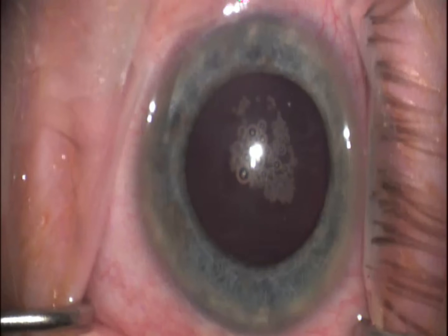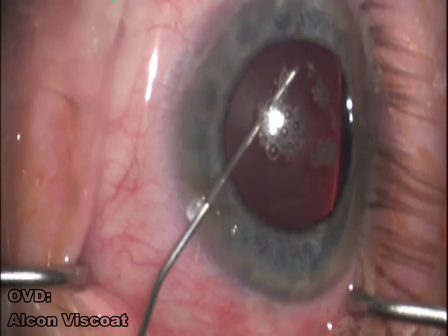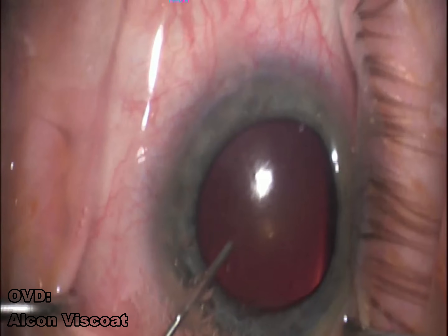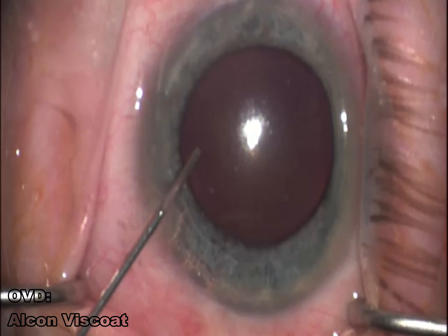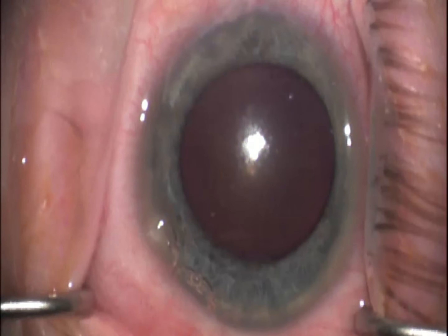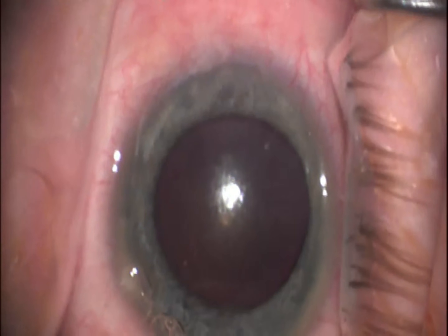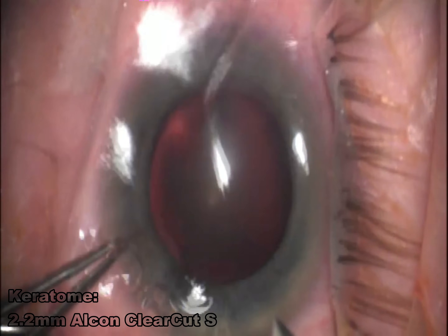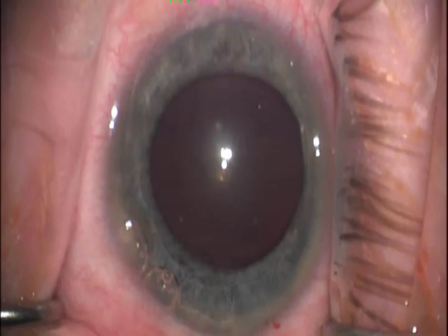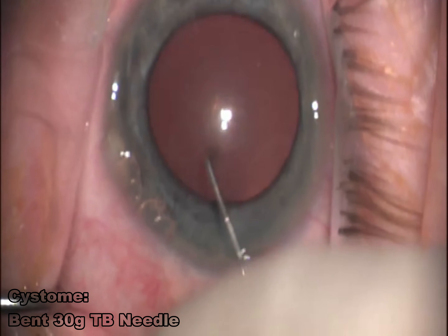I specifically use Alcon's Viscote as my dispersive viscoelastic for all my cases. I think it does a great job of protecting the corneal endothelium, and it comes in that Duo Visc container where you get both it and ProVisc. I create a 2.2mm keratome using a metallic blade. I prefer the metallic over the diamond because the diamond can sometimes cut a little bit too quickly, and any lateral movement will expand that wound.